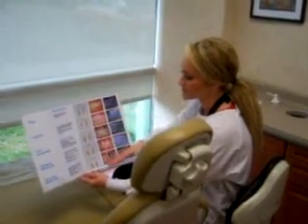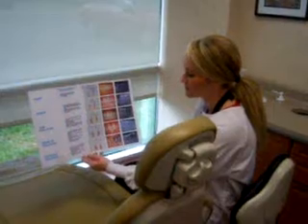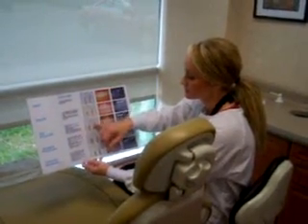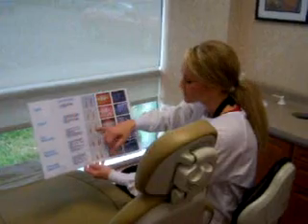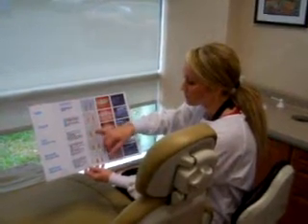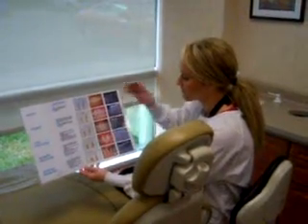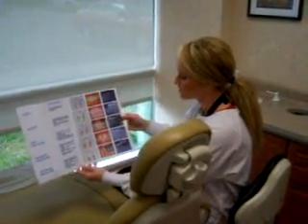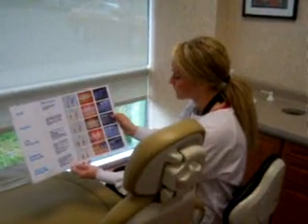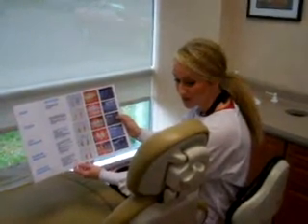Whereas periodontal disease is the actual destruction of the bone, and it's caused by many types of bacteria. These bacteria not only eat at the tissue, but they begin to eat at our bone. So now when I drop in here, I'm going to get numbers ranging around four millimeters. We'll see some puffiness and bleeding, but what's most important is when we look at the x-ray, we can actually see the enamel here, and where that enamel ends, we can see that this bone has dropped down.